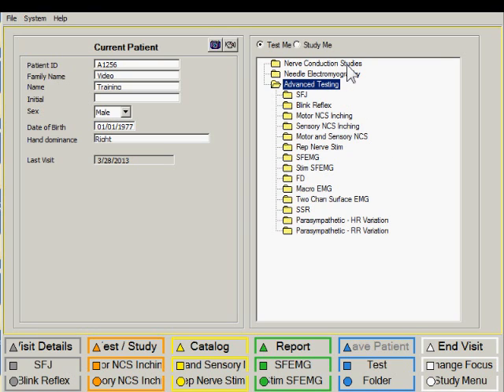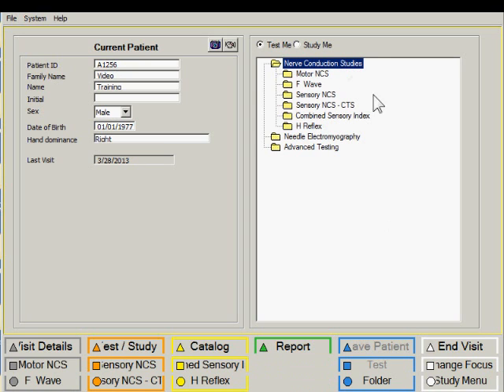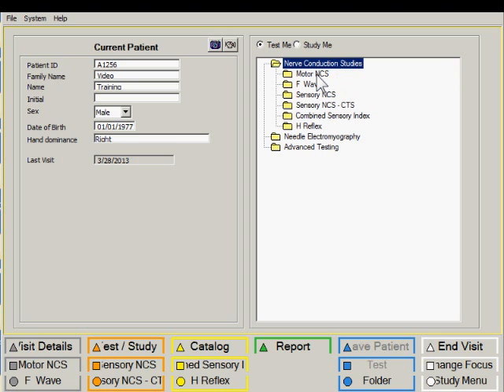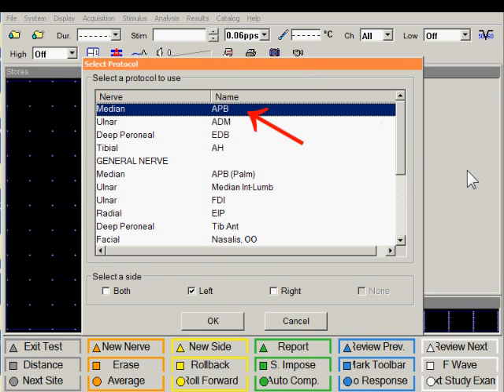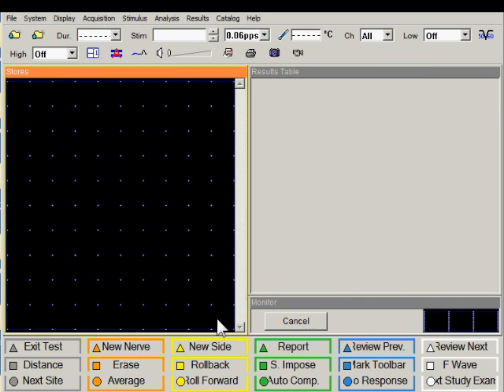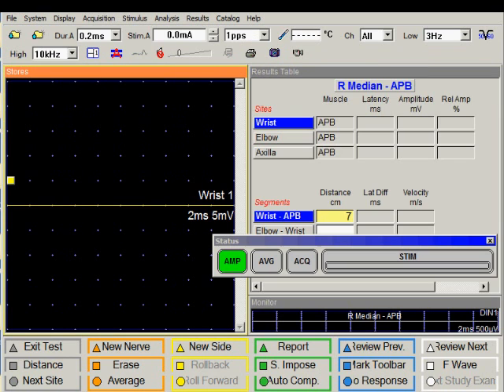The operator can decide which test to perform and select it from the test folder. So for example if one wanted to do a median motor nerve conduction study it can be found in the nerve conduction studies folder, in motor nerve conduction study. I will double click on it, then choose the median nerve, choose the tested side, click on OK and perform the test procedure.